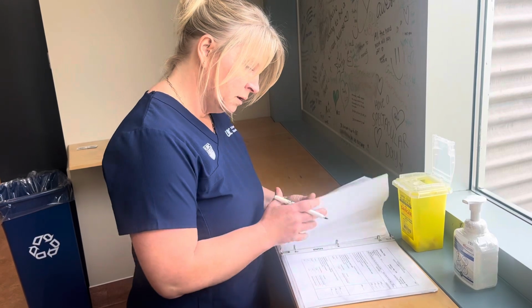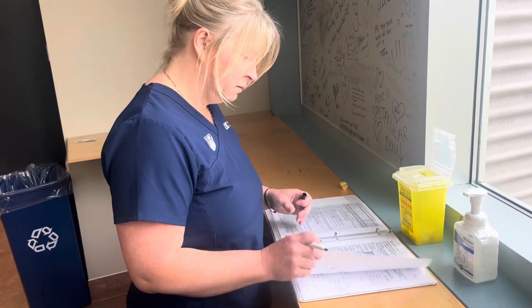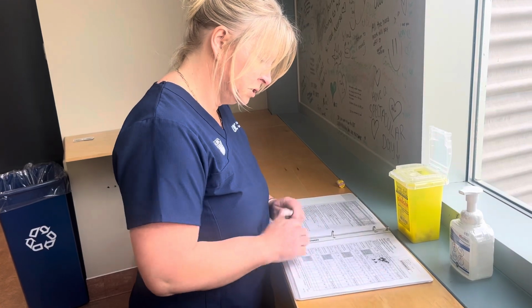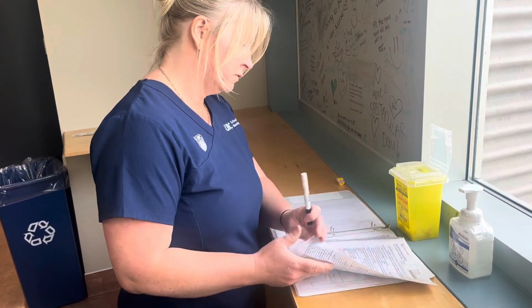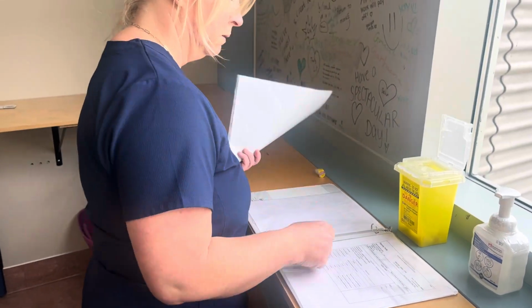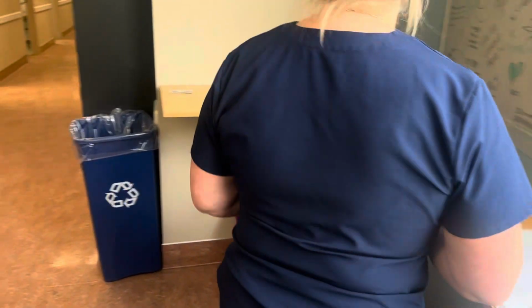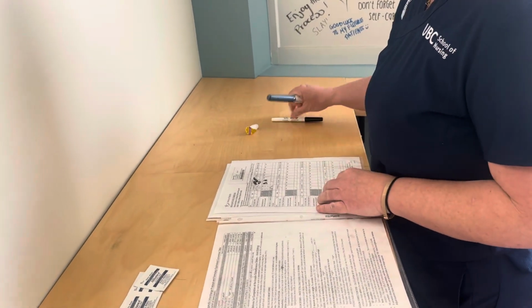So, moving over to the Omnicell now, I am going to take my MAR over there. I'm going to go in my Omnicell. I'm going to do my 5 rights.